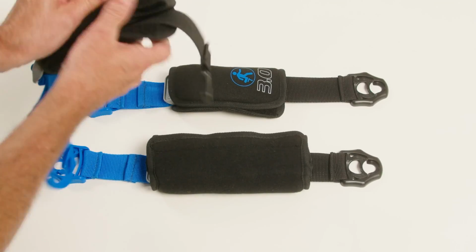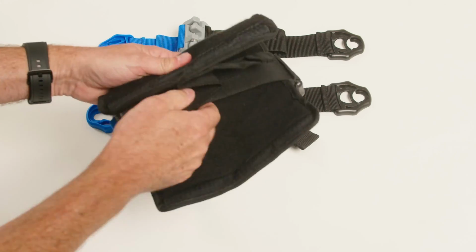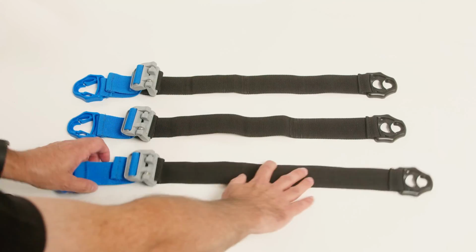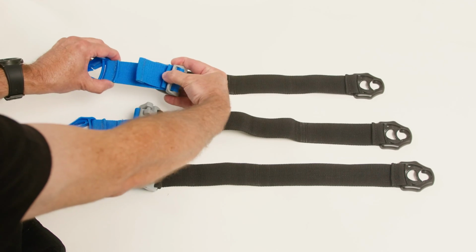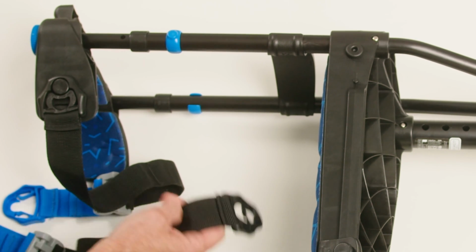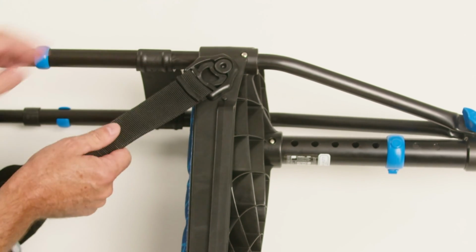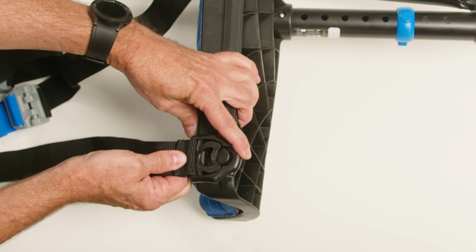Now let's install the straps onto the crutch. First, remove the pads from the straps. You will reinstall them later. Fully extend the black webbing, then fully extend the blue webbing. Repeat for the other two straps. Install the black T-lock buckles onto the crutch. The black buckles go on the inside of the patient's leg. For right leg use, install the black buckle on the left side of the crutch. For left leg use, install on the right side.